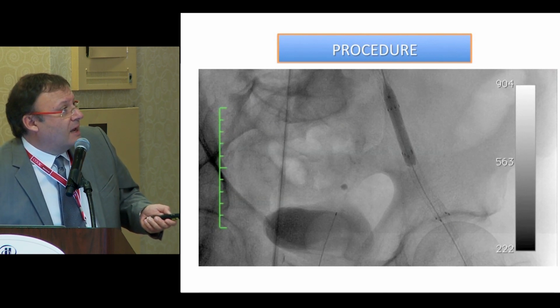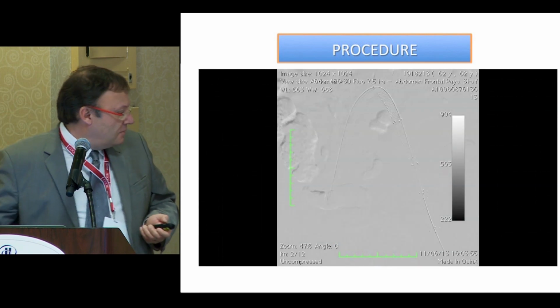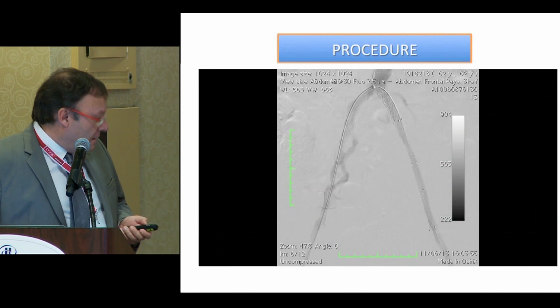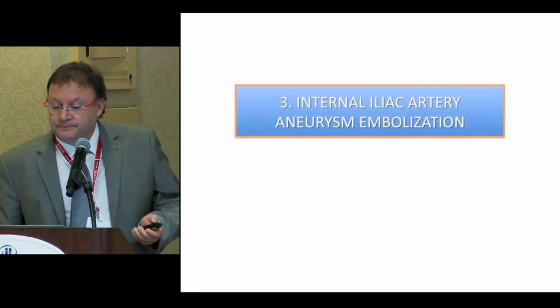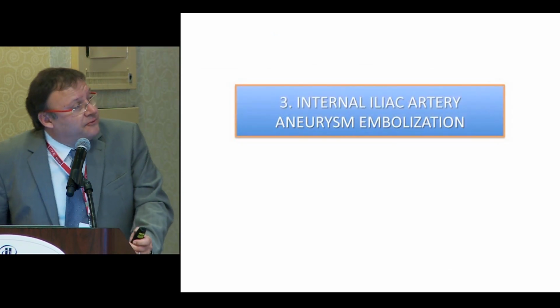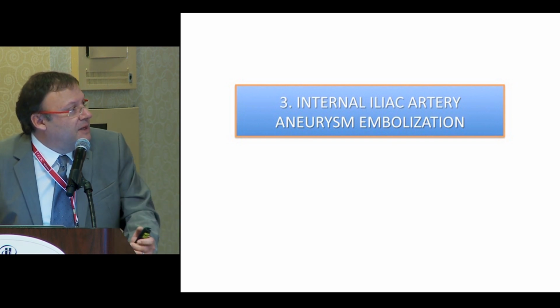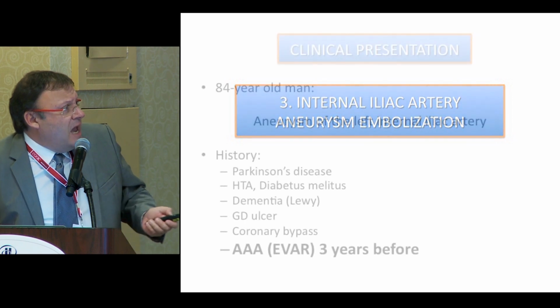And we were able to do an angioplasty at the origin of the common iliac, and deployed with accuracy a stent at the origin of the iliac. The stents you're placing through the robot. Yeah. Patient was well too. Two cases of embolization that could probably show some interest of the robotic aspect.